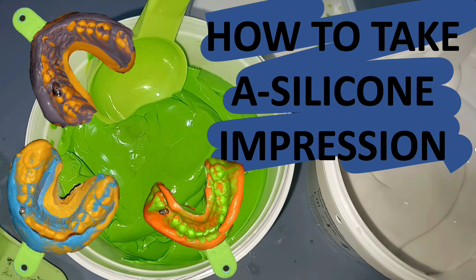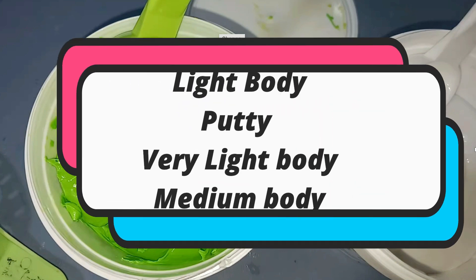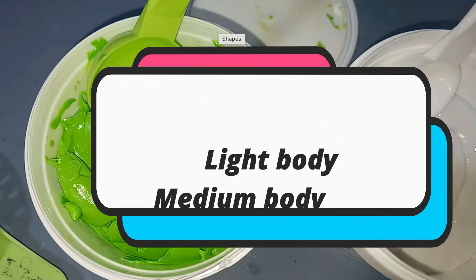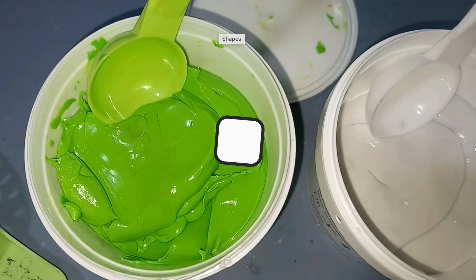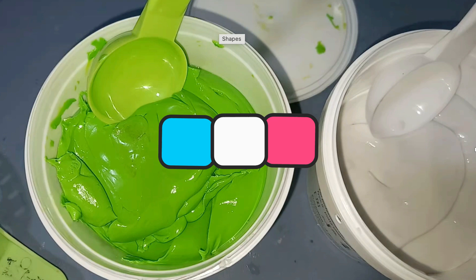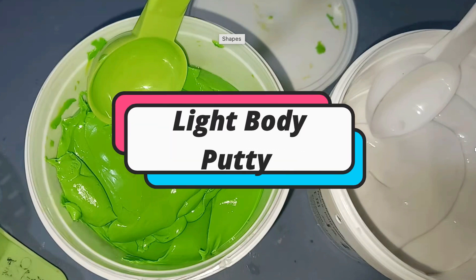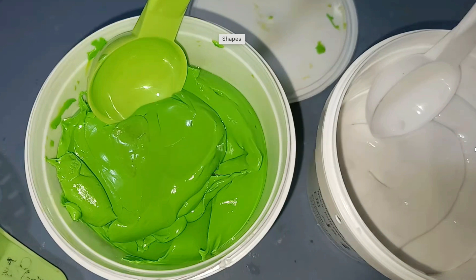Silicone material is available in various forms: light body, putty, very light body, and medium body. In this video, we are going to discuss the single step technique of taking an impression using a silicone material. In this technique we are using light body and putty. Putty is available in containers — two containers, one containing base paste and the other containing catalyst.